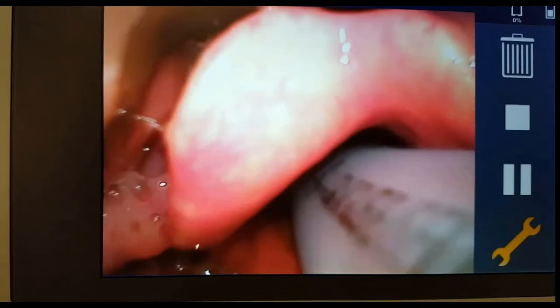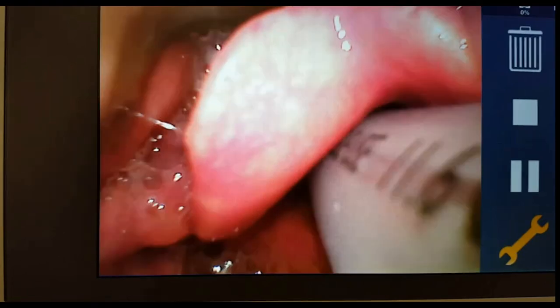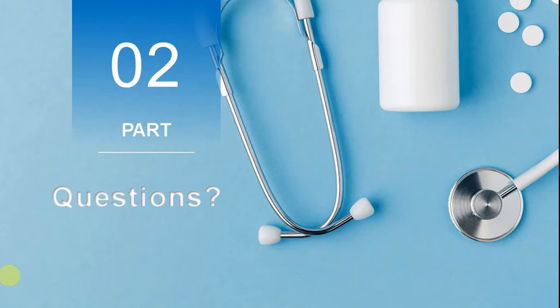That is how intubation is performed with a video laryngoscope. On this occasion we used the C-Mac, but the same principle applies to the GlideScope and other video laryngoscopes. We typically use this technique when we anticipate difficulties in intubating a patient. If you have any questions about the pitfalls, please feel free to ask.